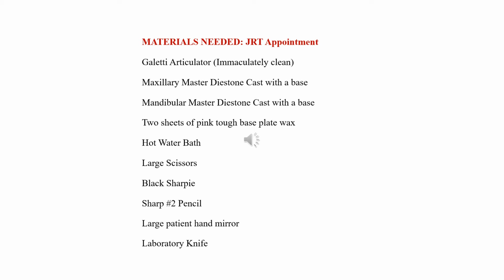And then a laboratory knife is needed very often to clean up or trim the casts. Now, the cast should have been trimmed before and properly studied, but I'm going to say 50% of the time there are problems on the cast that the assistant was brain dead and didn't inspect the cast beautifully and just brought it in incorrectly and can cause a lot of problems. So I'll need that lab knife to correct the cast if I see a problem.